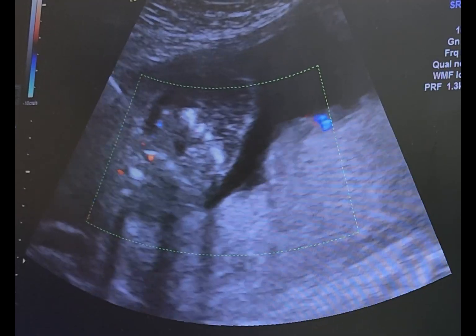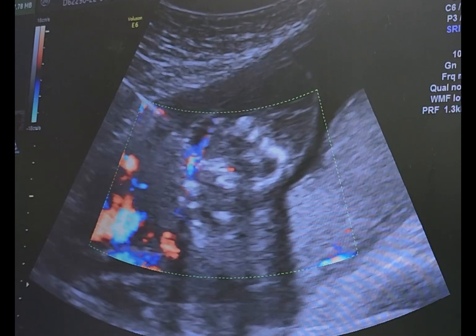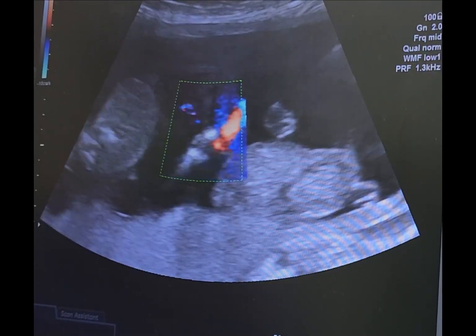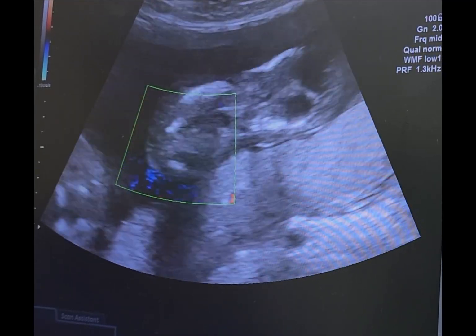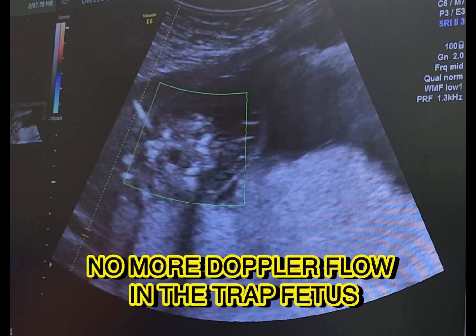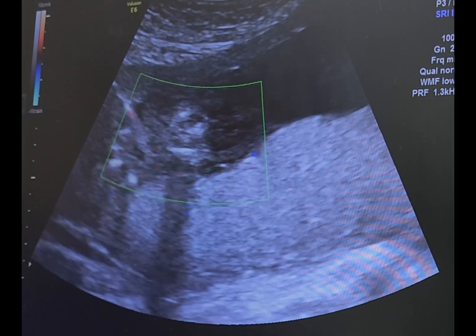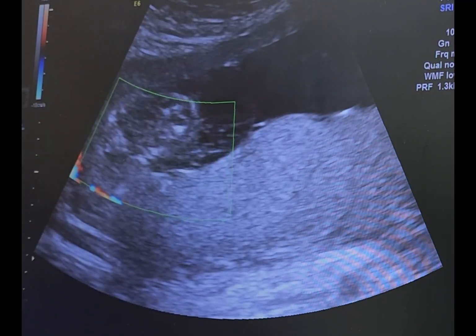Even without actively ablating, the tip of the needle here can also throw off artifacts on Doppler, which is quite chaotic, as you can see here. When we are finally happy with the cessation of flow in the cord into the baby, the needle is removed.